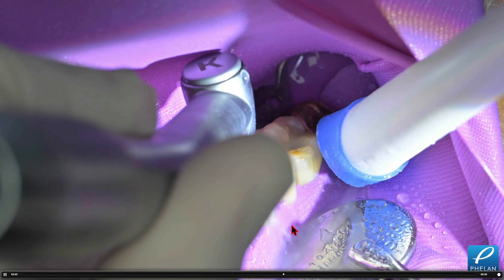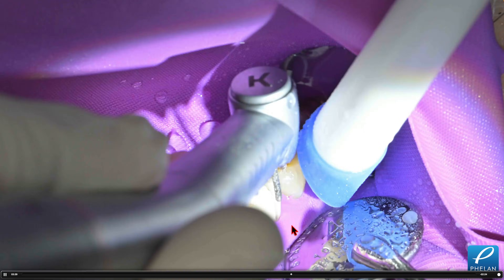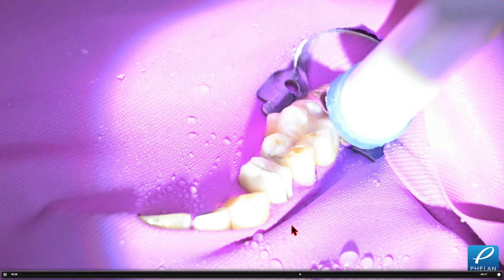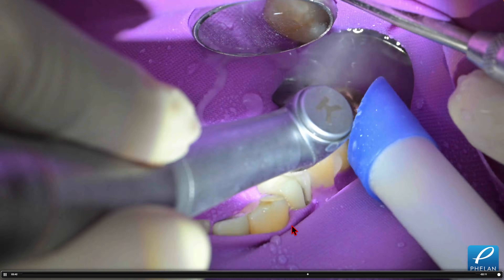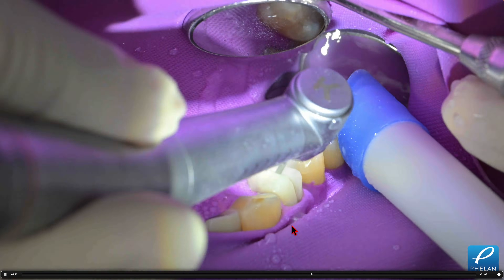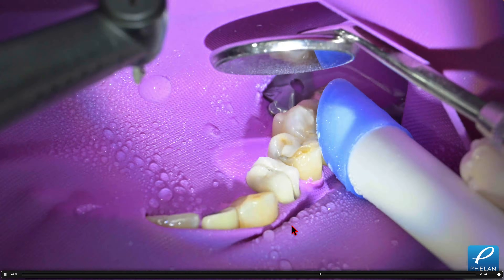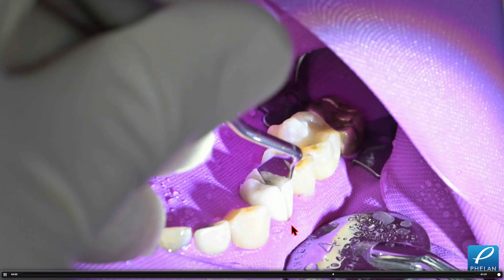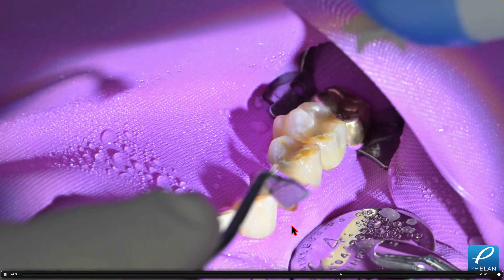You can't see all of this because of the way the boom camera is, but basically I'm cutting through the occlusal and through the lingual. This technique is really great for cemented crowns. If this was a bonded crown, I have to be more careful and maybe section it a little further. I don't torque too hard with bonded crowns because you can actually break off parts of the tooth. This works great with cemented zirconia crowns, metal ceramic crowns, or any kind of all-ceramic cemented crowns.